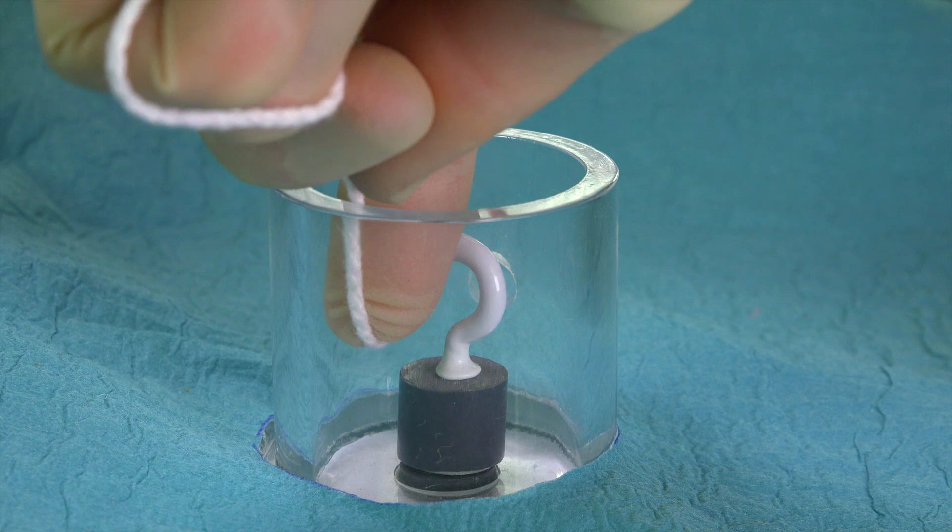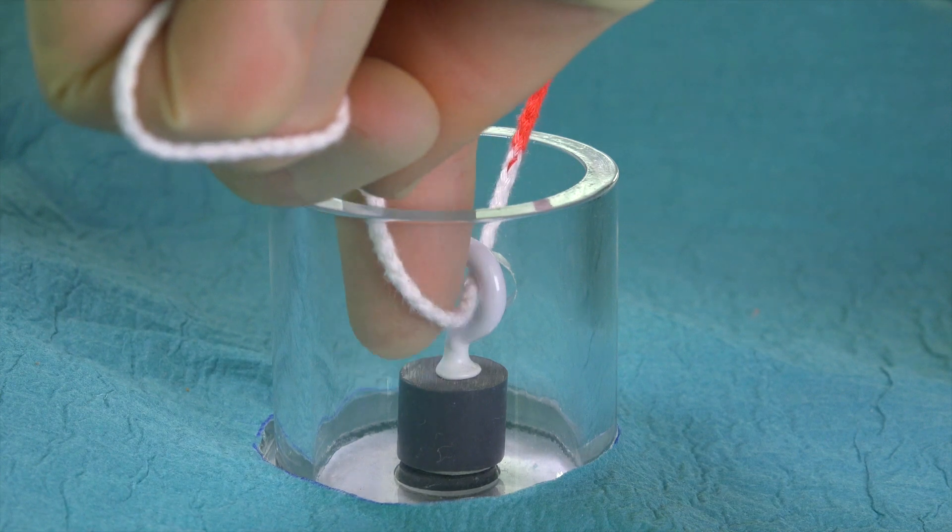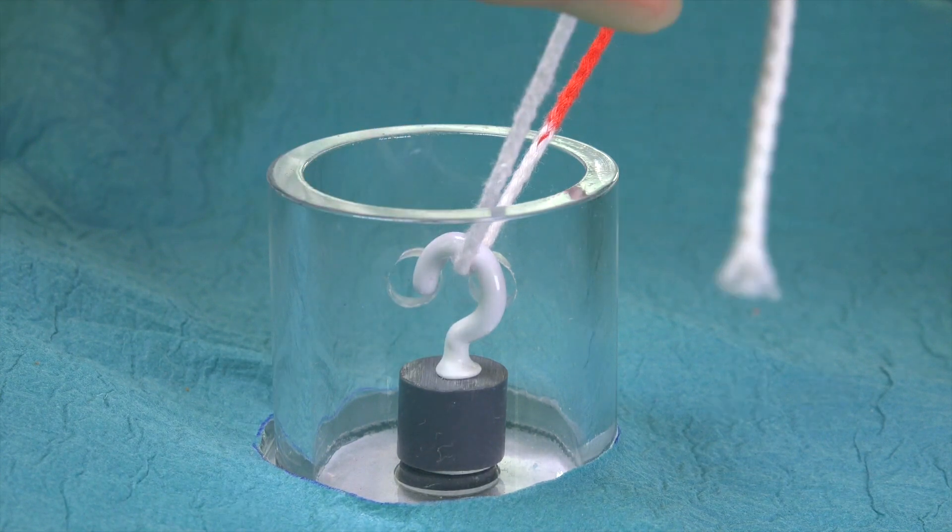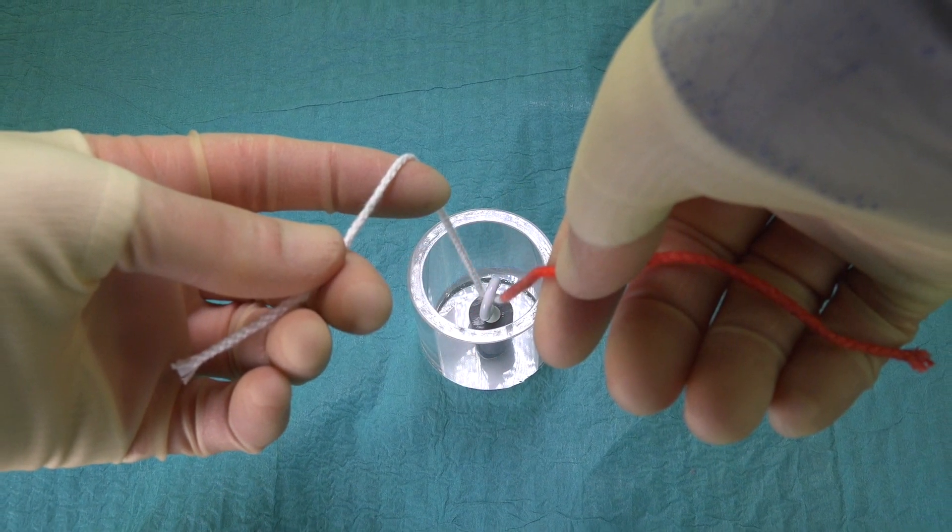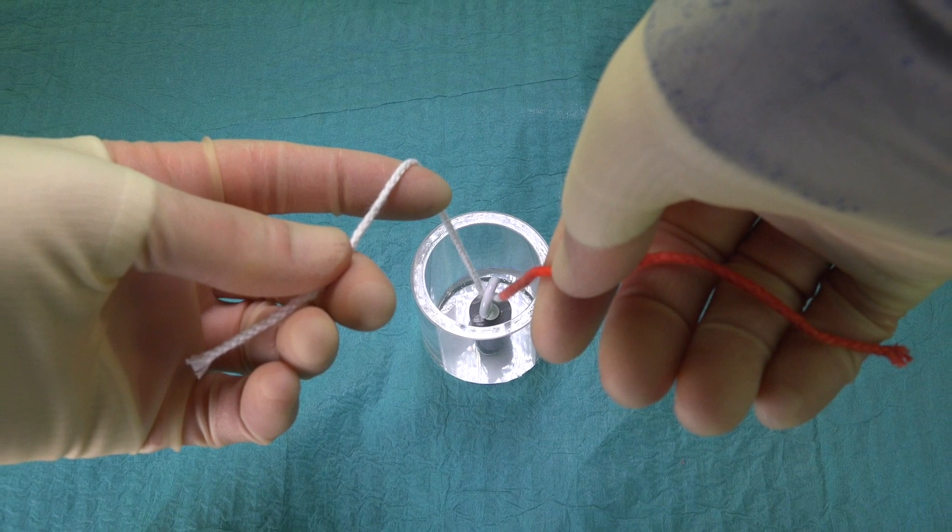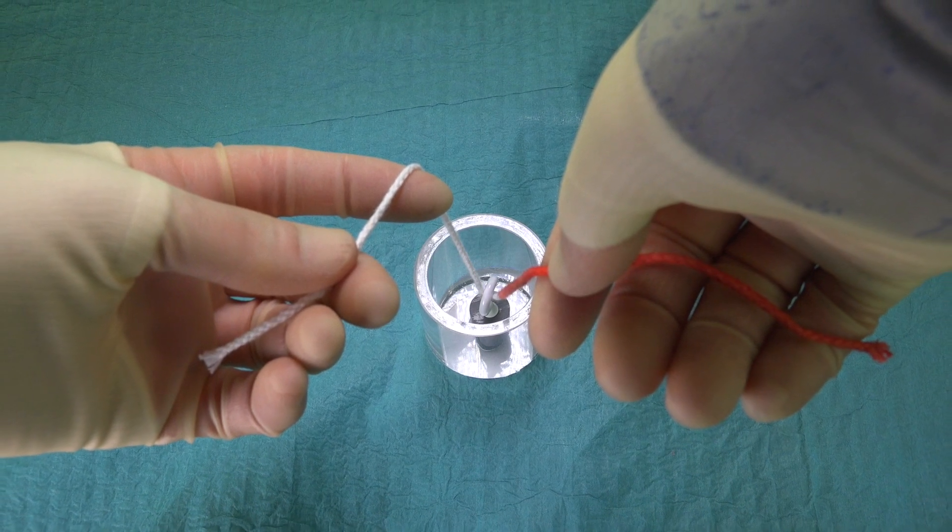To do this, we can use a clip, or we can use our hands as we're demonstrating in this case. Once the suture is hooked, we then hold the two ends in the identical manner as we would when performing a simple hand-tied reef knot. The only difference is that the hands are positioned closer together.